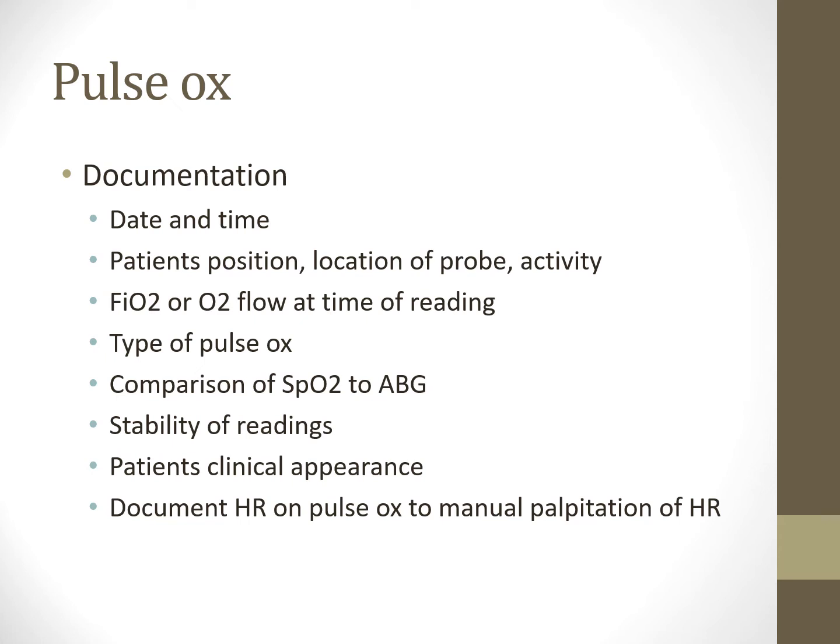Now, Biomed actually has an artificial finger. It's pretty funny. It's an artificial finger that you can put a pulse ox on, and it has a known value, so you can correlate it there. So biomedical people are awesome at having those little things to check for accuracy, not at the bedside, but obviously overall accuracy.